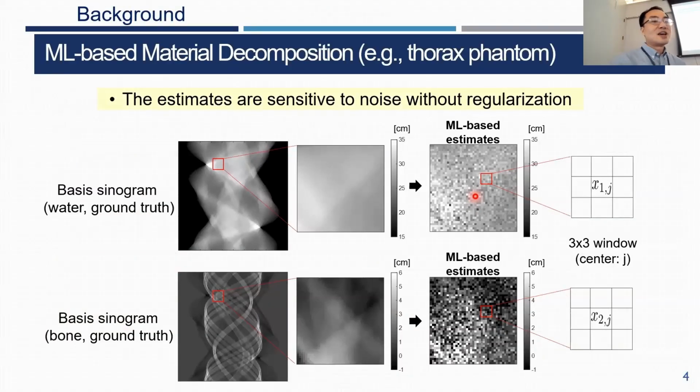But then you would have to apply image-based material decomposition or MBIR afterward. Here, I can hardly imagine what the statistics are after you apply a non-local filter in the energy-wise projection. But here we have statistics. It's possible.